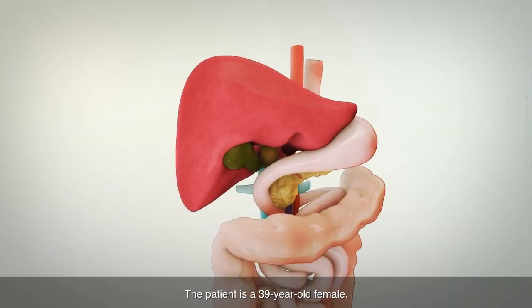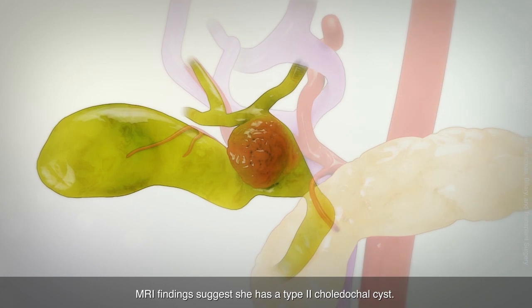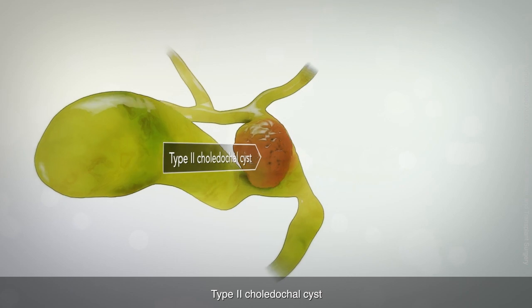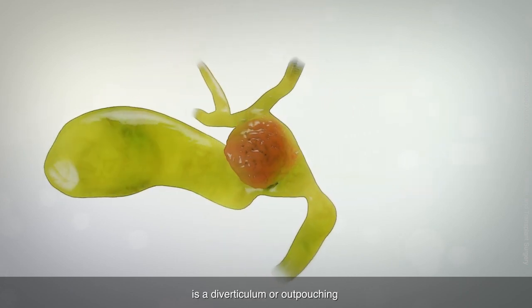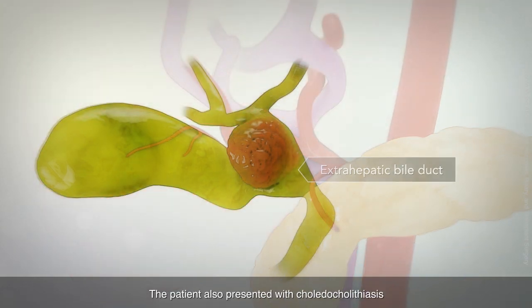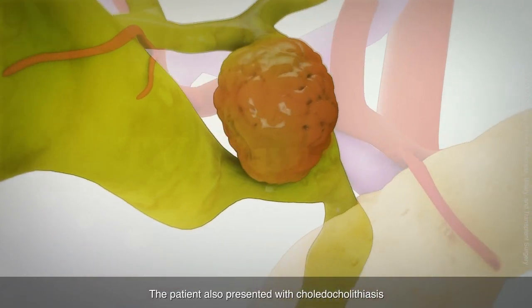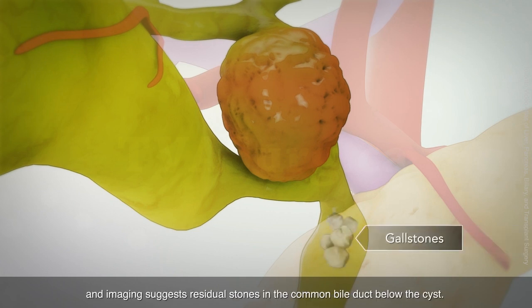The patient is a 39-year-old female. MRI findings suggest she has a type 2 choledochal cyst, which is a diverticulum or outpouching of the extrahepatic bile duct. The patient also presented with choledochal lithiasis, and imaging suggests residual stones in the common bile duct below the cyst.